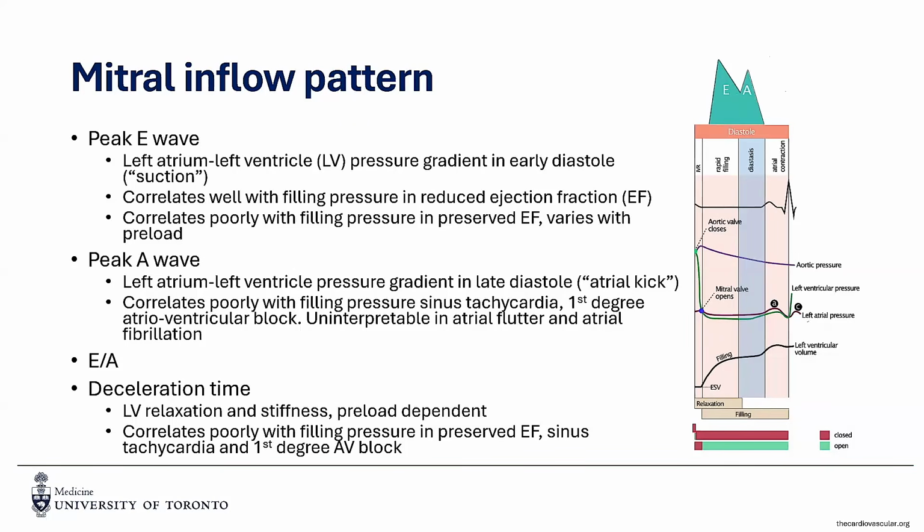The final situation where oftentimes your A wave can't be used is obviously in atrial fibrillation and also atrial flutter, because the A wave is almost entirely uninterpretable.